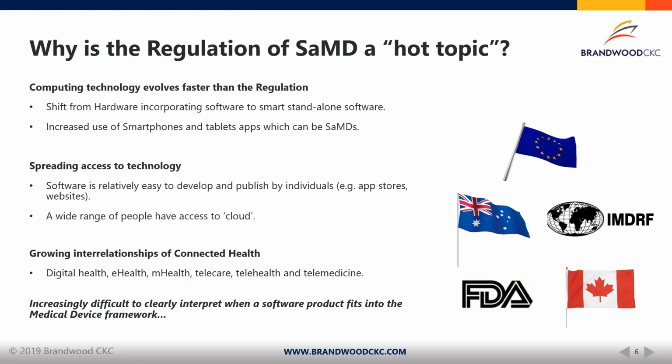There's obviously also an increase of platforms where the software can be operated, such as smartphones, tablets, and broad access to the cloud, which means that individuals can access more and more of those kinds of medical devices. Obviously, connected care is also one of the trends in medtech. And this also raises questions as to whether some of those platforms and software products become medical devices or not. So it's increasingly difficult to clearly interpret and delineate when a software product fits into the medical device framework, and that's what we're going to try to shed some light on today.